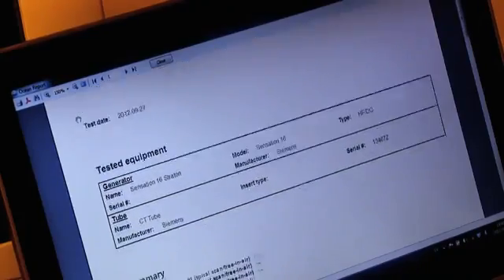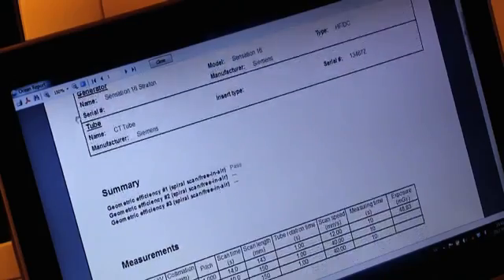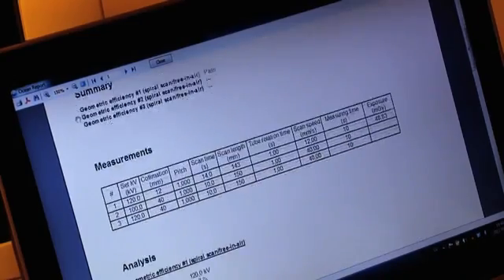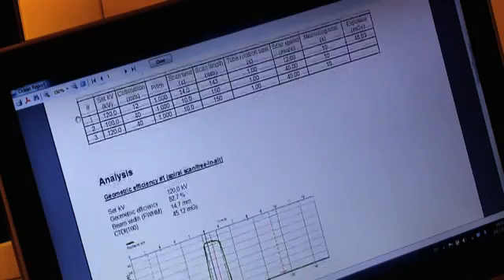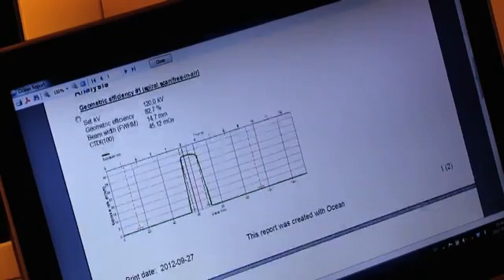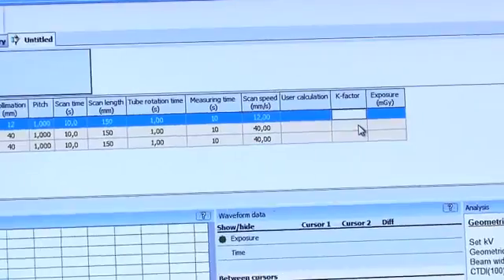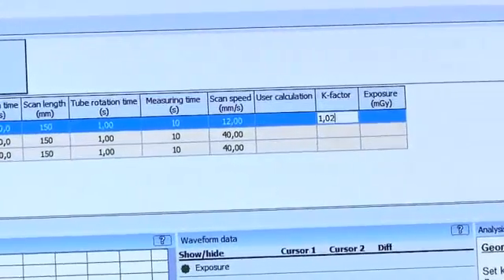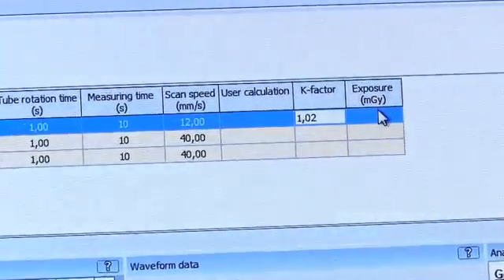To print a customized report, just go to Reporting. For Ocean professional users, you can of course customize the measuring template any way you like. For instance, you can add your own calculations and add your own K-factor.